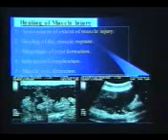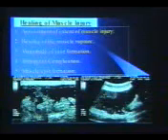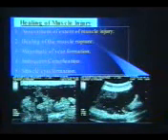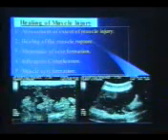Infrequent complications like cystic degeneration. This is again a pathology, a healing process where the muscle undergoes cystic degeneration, and here we can see the degeneration of the muscle. Total normal anatomy has gone. These are the fat globules which are seen floating in this degenerating muscle, which you can see here. This is a chronic muscle injury which ultimately led to cystic degeneration of the muscle.